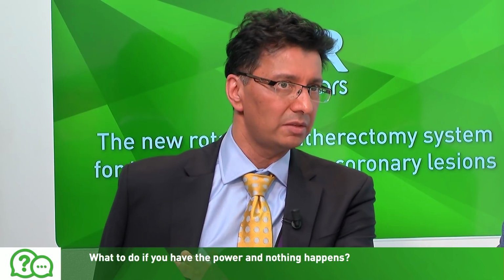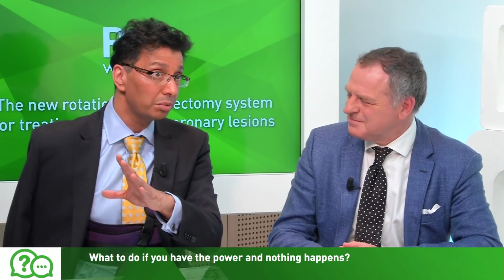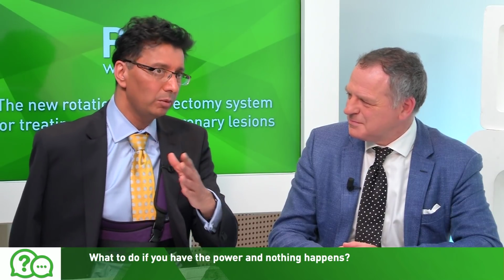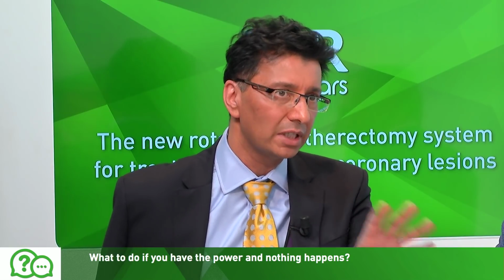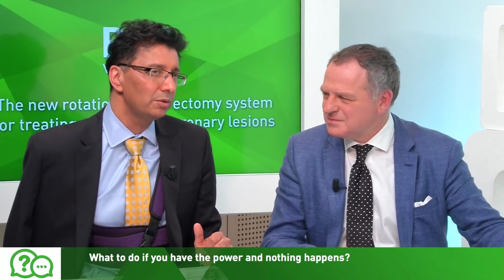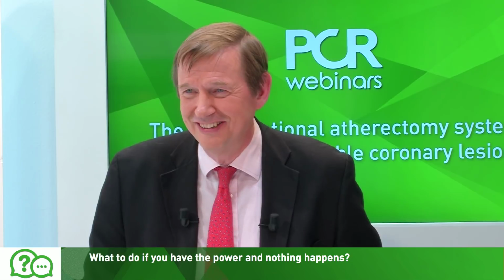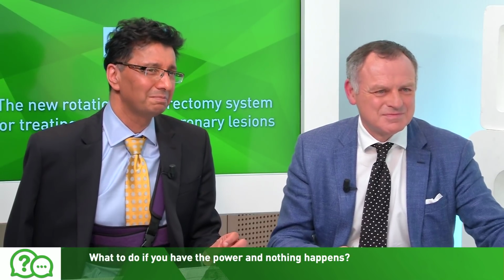But the other things you've got to check, obviously, is that your gas cylinder hasn't run out, so you need to look at the gas cylinder and make sure there's adequate pressure in that, and from the training people will know what pressure they need for their cylinder, and that your connections haven't come apart, because sometimes that can happen. So looking at those three things is what your sequence should be. Yes, one of the things I found is it's rarely the equipment that fails. It's nearly always one of the steps you have to go through to make sure that you have made the equipment work as it should.